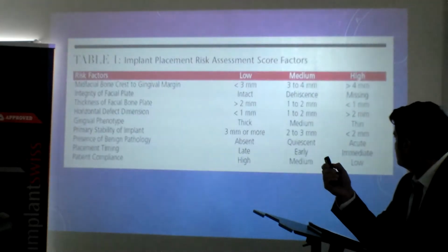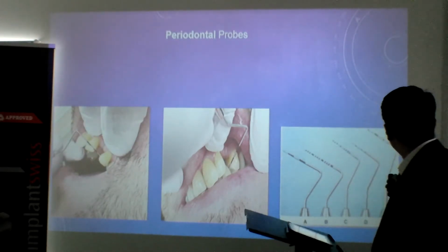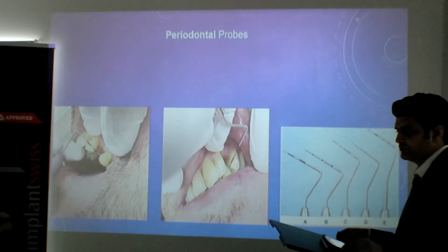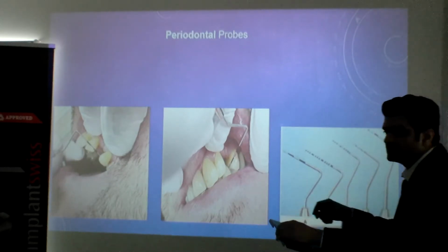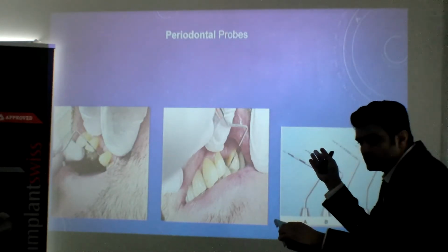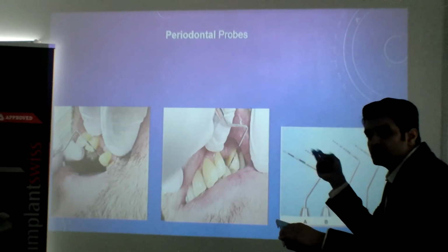We do talk about these millimeters, but that's why I was talking about probes. This is the WHO probe, isn't it? This one, right? It's not the best image, but what is different about the WHO probe? Not special, but different. So the bottom, what's the diameter of that? More than half a millimeter. Yeah? It's very difficult to perceive otherwise, and this is an ideal tool for you to start perceiving how many millimeters you've got. So start using it for BPE, and start using it to measure the ridges.